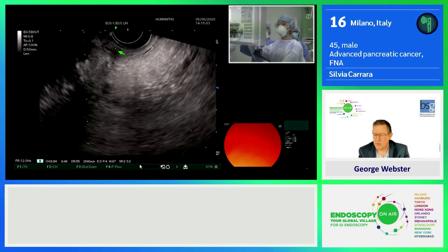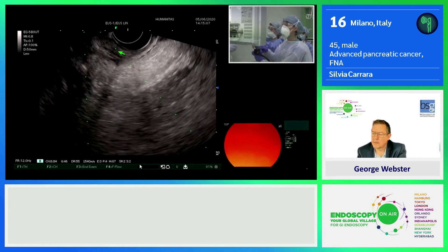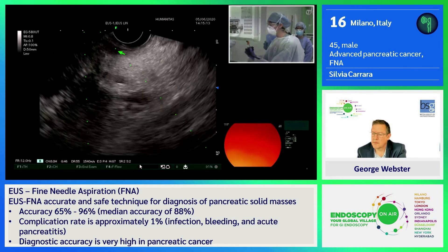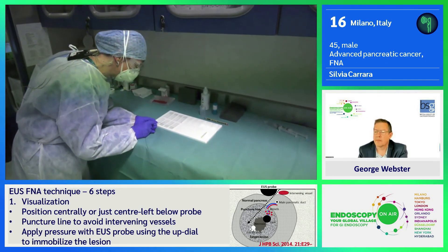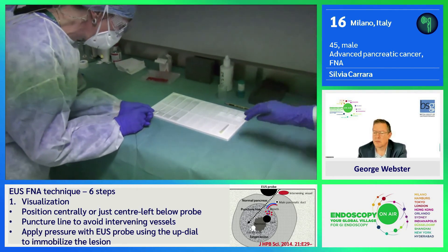We release just the needle so the platform stays in. We withdraw the needle, and I will show you how we process the material. We use MOSE, so it is the endoscopist who assesses the quality of the material obtained with the biopsy.